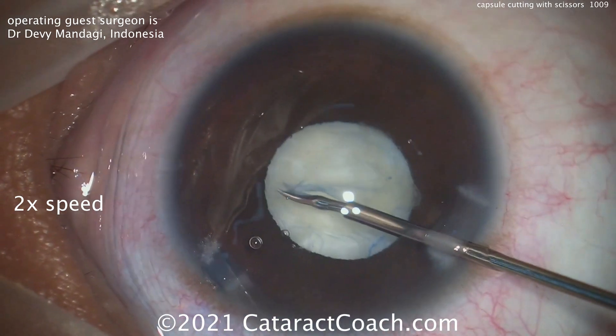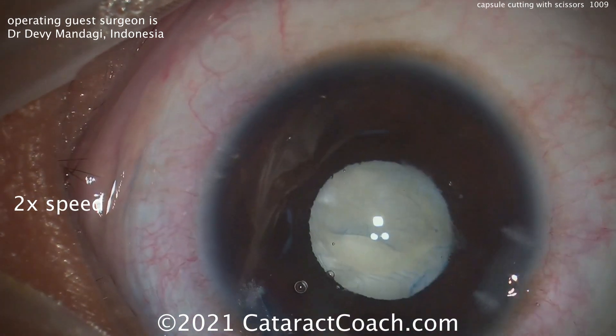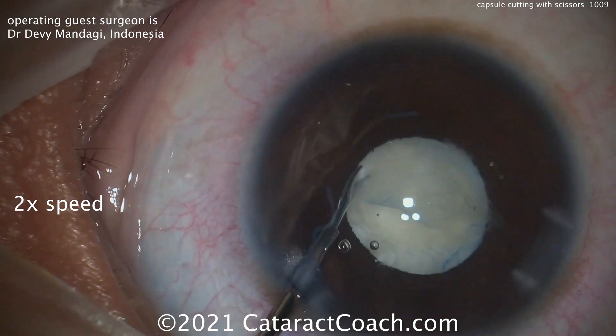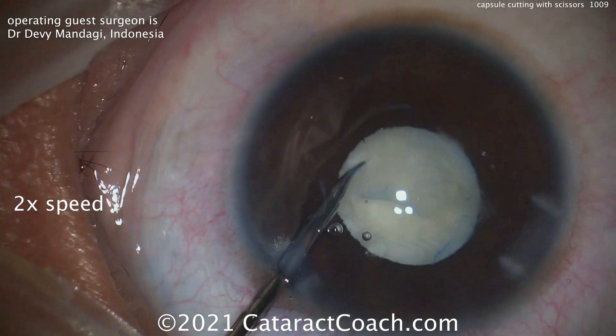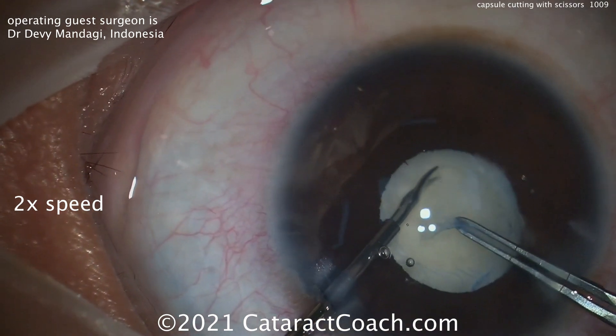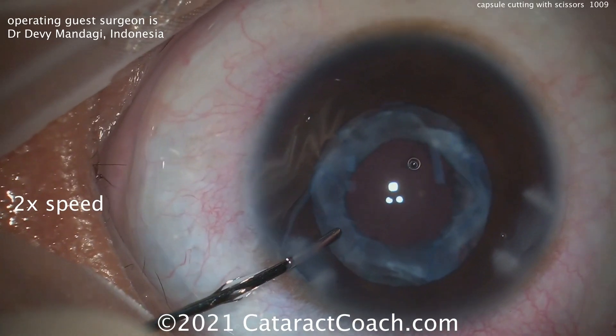You've got to use these scissors. This is most commonly seen in white cataracts that are present in patients for a very long time, and you may have to resort to something like this — using micro scissors to cut it. Now could you use a half-million dollar femtosecond laser too? Of course. But not everyone has access.